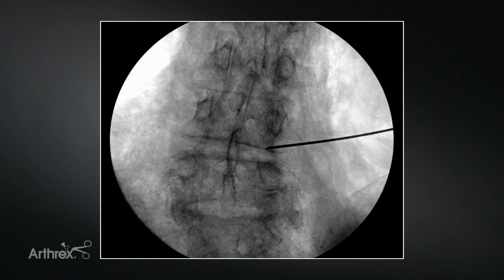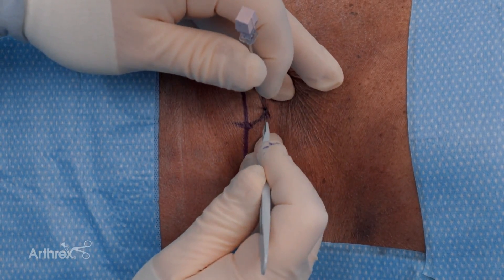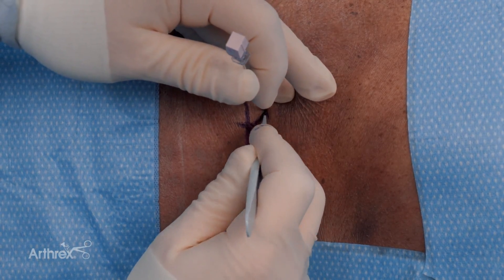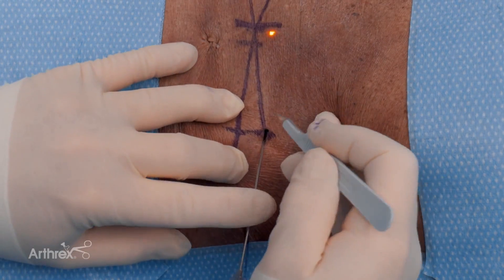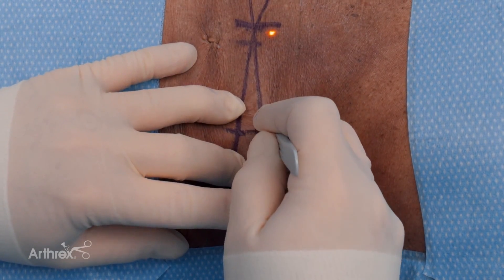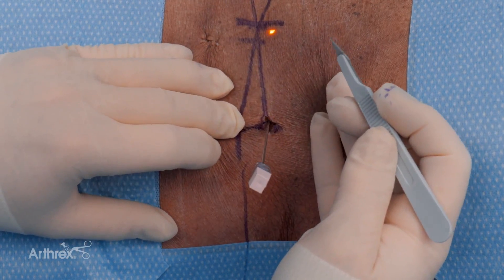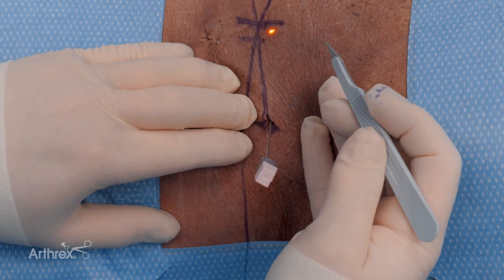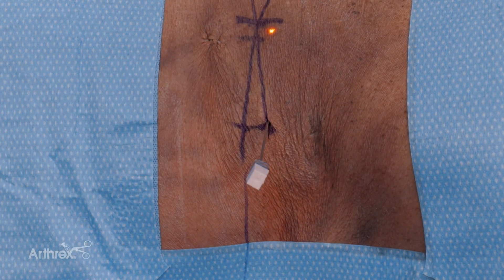Now we'll make our incision. If you pull on the needle in the skin, you can get a little gap between the needle and the skin. If you cut away from the needle, you'll be able to make one clean cut on either side of the needle in Langer's lines. We do them in Langer's lines because there's less tension on the wound and it heals up very nicely — sometimes you can't even find these scars a year after surgery.